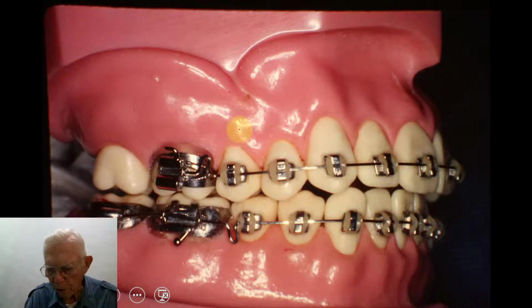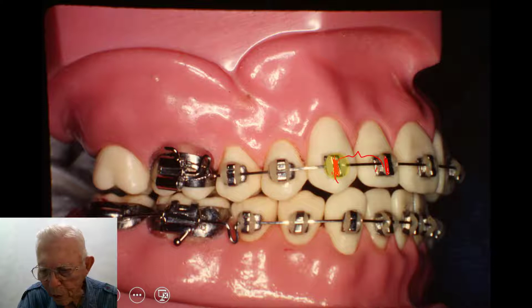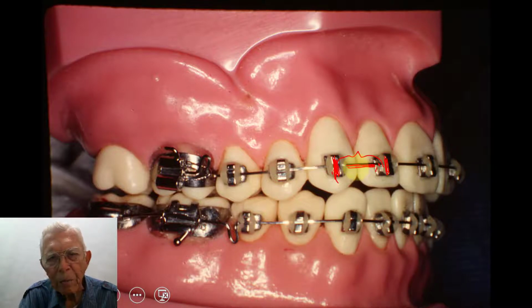Now this little single bracket has a vertical slot in it, and you can use that, but you've got a space right here, and then you have your bracket space over here. Now the base of the bracket doesn't count as a space, so your space comes all the way from this side of the bracket to the other side. And now you can make a bigger bend in the wire. In other words, you can add more torque to it, or more twist, or whatever you want to do, in or out, or up or down in that bracket, since you have a greater space. Whereas if you've got twin brackets, your space is reduced considerably.